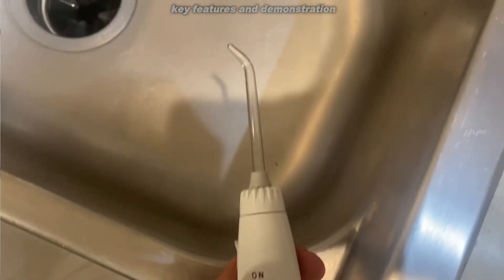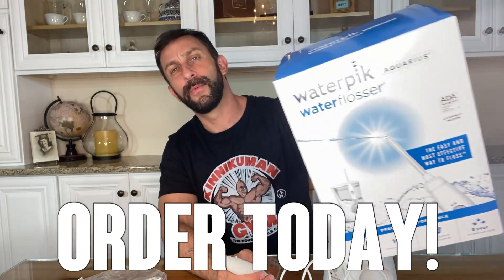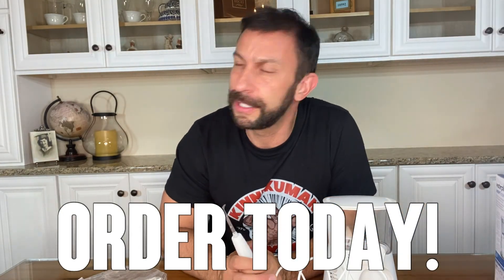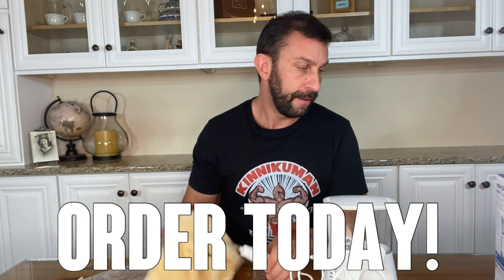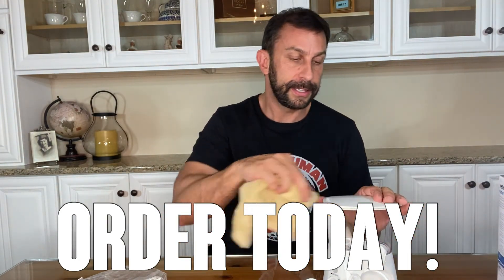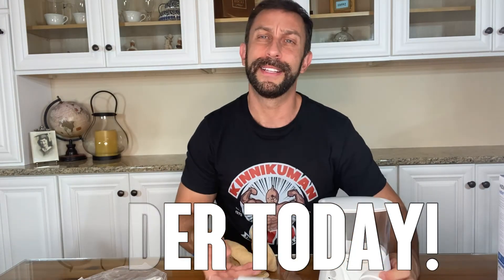So if your teeth are important to you and you want to get them in the best shape of your life, go ahead and order today — you won't be disappointed. Waterpik is a best-selling brand on Amazon, one of the best-selling brands in the world, and one of the most trusted water flosser brands ever in existence. So if you're looking for one, this is the right one for you. The price is fantastic. Available on Amazon with Prime, free shipping, free returns, and an A-to-Z guarantee. This thing is absolutely fantastic — order today, you won't be disappointed.